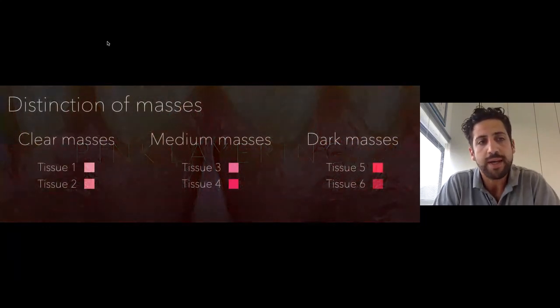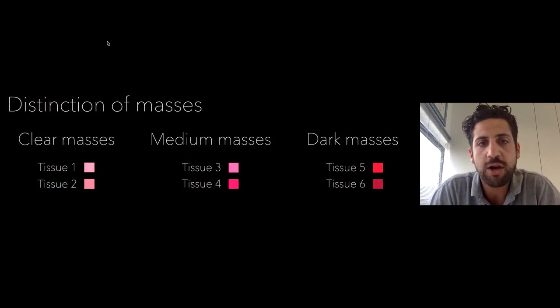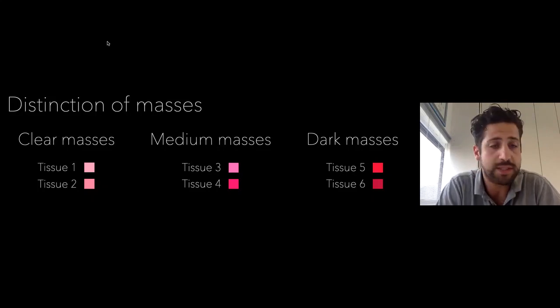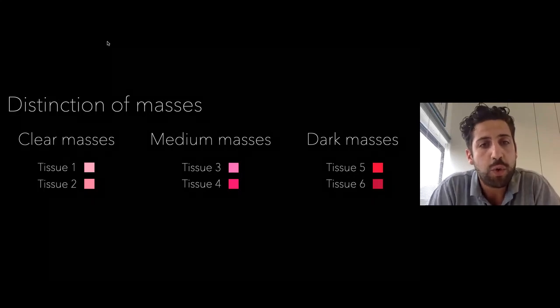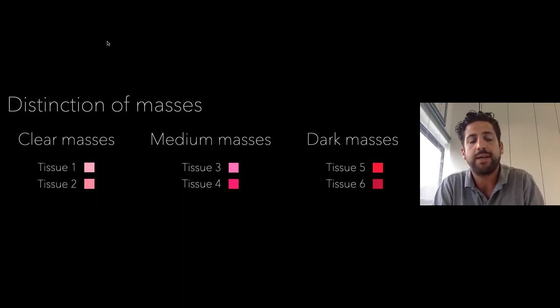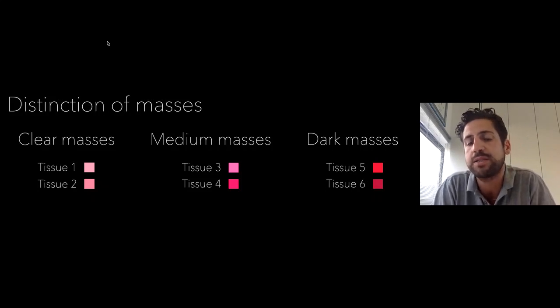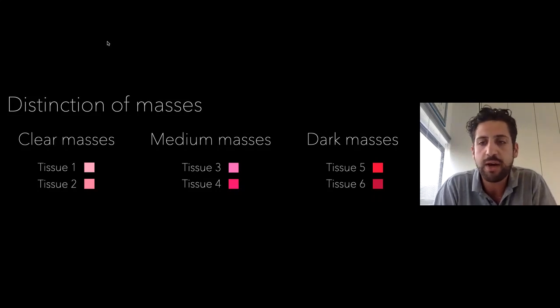First of all, the distinction of the masses, the distinction of the colors, is really important. If we speak about ice ceramic by Zirkonzahn, it's really important to divide the colors. For example, we have tissue 1 and tissue 2 that I use for the clear masses. Medium masses are tissue 3 and tissue 4, and for the dark masses at the bottom of the gingiva, we use tissue 5 and tissue 6.